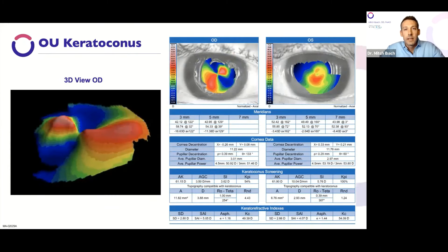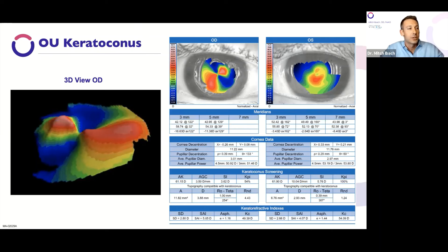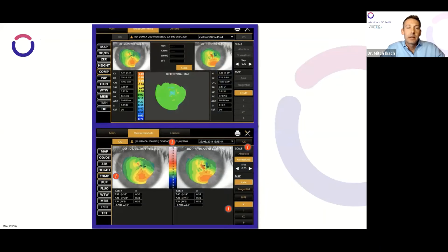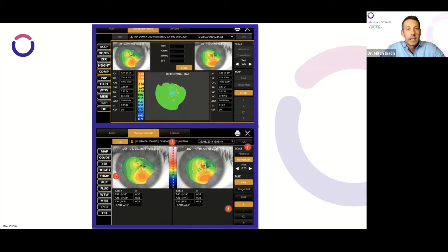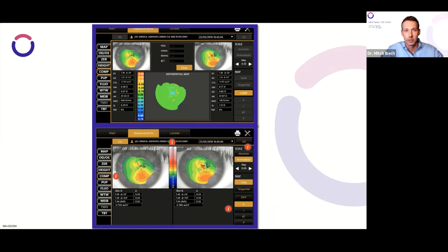This is the 3D view of corneal elevation — it almost reminds me of a visual field printout, and I think it's really useful for patient education. The 3D view might also help for some specialty contact lens fits. Arguably the most important printout for me is the comparison map — we're able to compare topographies over time with serial analysis to look for progression. Being able to show what 2018 versus 2019 looked like is extremely important for showing progression and rate of change. It's also important after a patient's had corneal cross-linking, to confirm that cornea has been stabilized, and it's important for insurance and reimbursement.